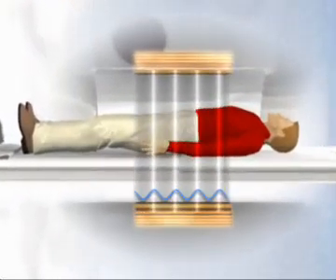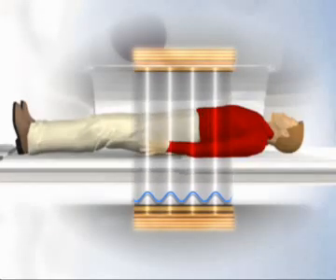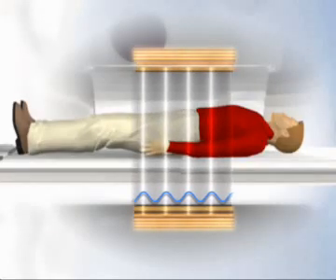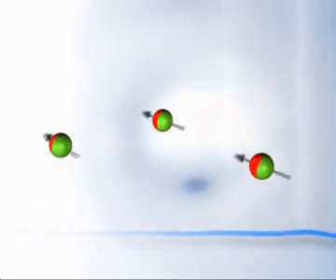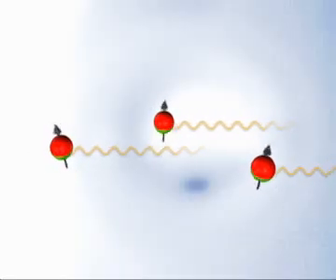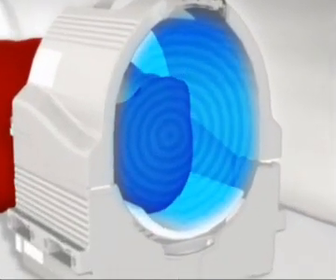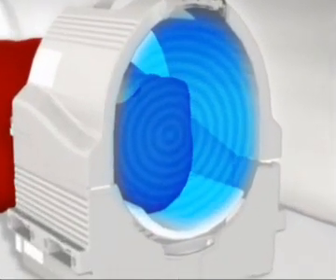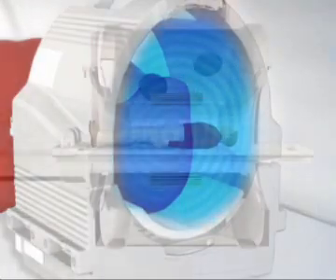A transmitting coil in the magnet generates the alternating magnetic field in the area under examination. After being excited by high-frequency energy, the atomic nuclei return to the equilibrium position parallel to the static main magnetic field. The atomic nuclei then emit electromagnetic waves in the frequency range at which they were excited. Receiver coils arranged around the patient detect these weak RF signals.